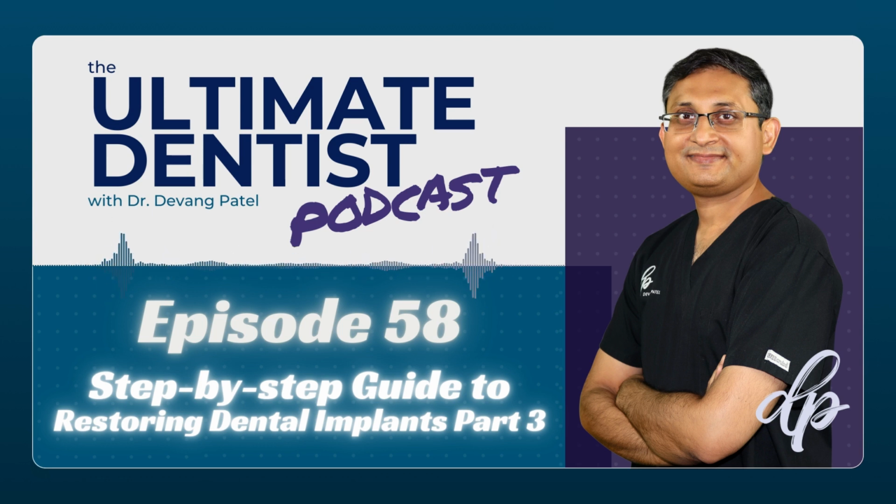It's no issue. Whereas with a cement retained crown, if the screw becomes loose but the crown is still cemented onto the abutment, it's difficult to get to the abutment. If the patient has chipped the crown, it's difficult to take the crown out, disassemble everything, send it back to the laboratory and cement everything back again. So it becomes a bit difficult to maintain.